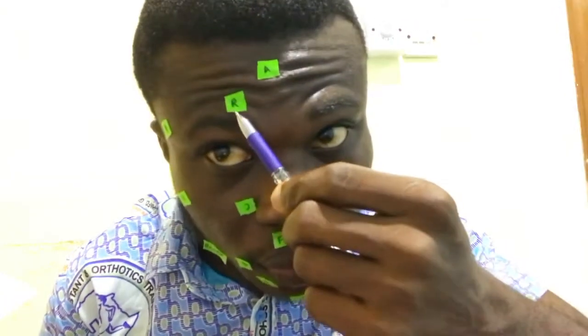In the case of Bell's or facial palsy, these areas can be used as areas to receive our electrode pads, and the stimulation will have effects on the particular structure on which it is placed.